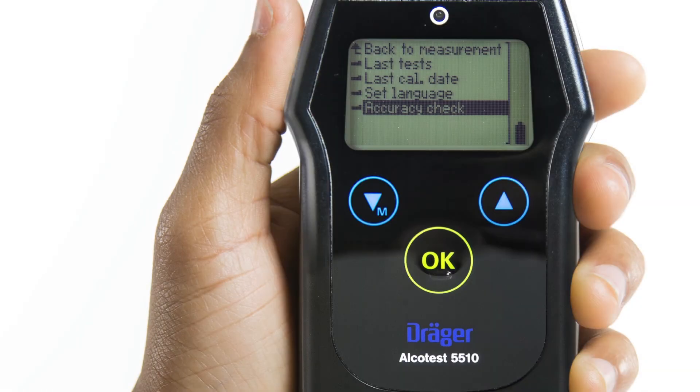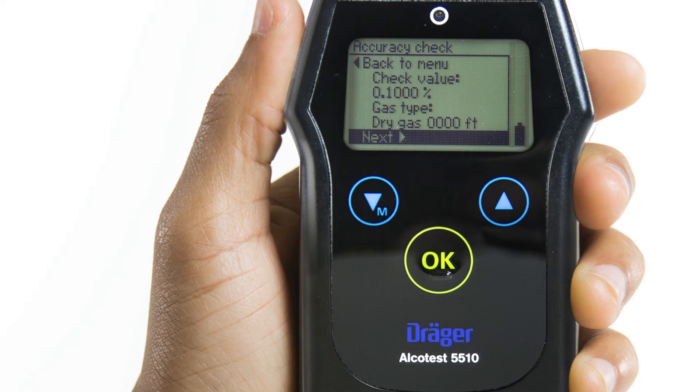The Accuracy Check menu lets you perform an accuracy check of the device according to the configurations defined in the main menu which is pin protected.